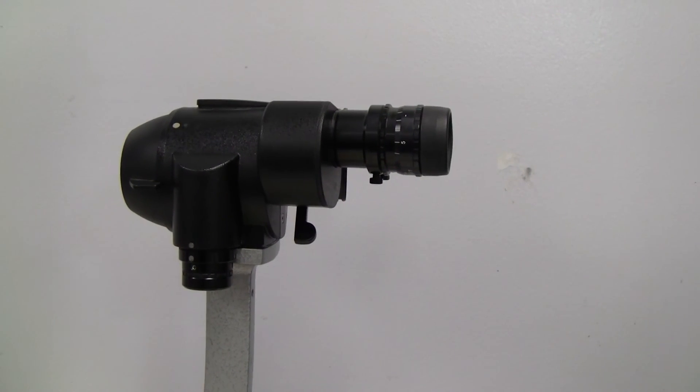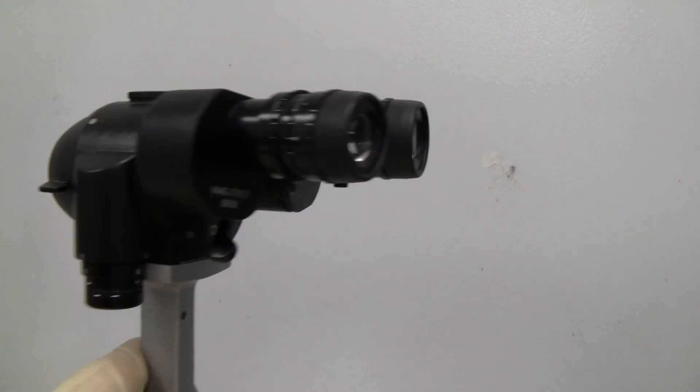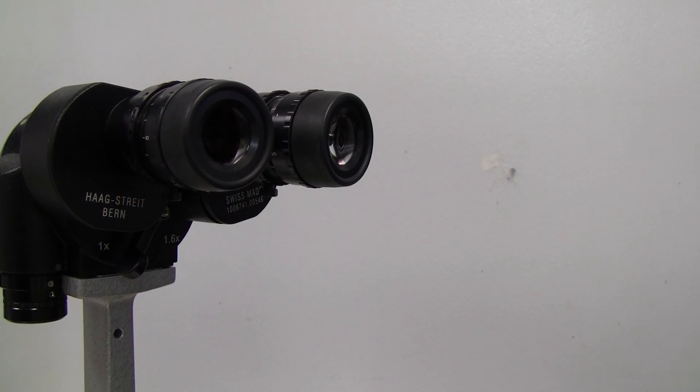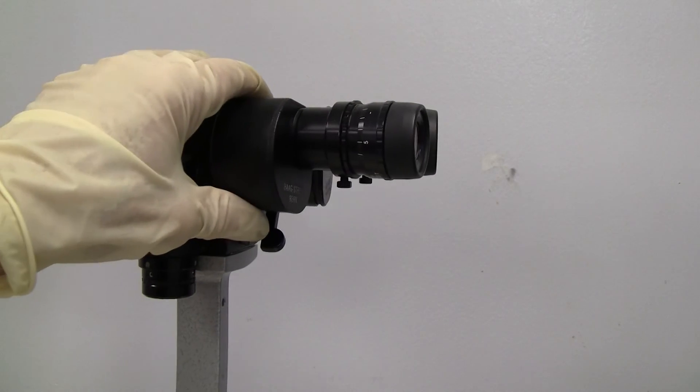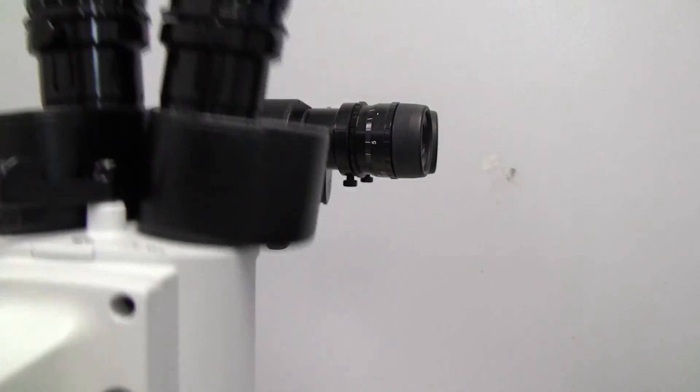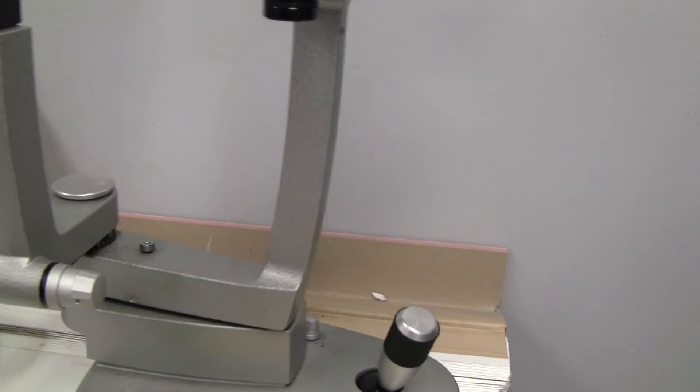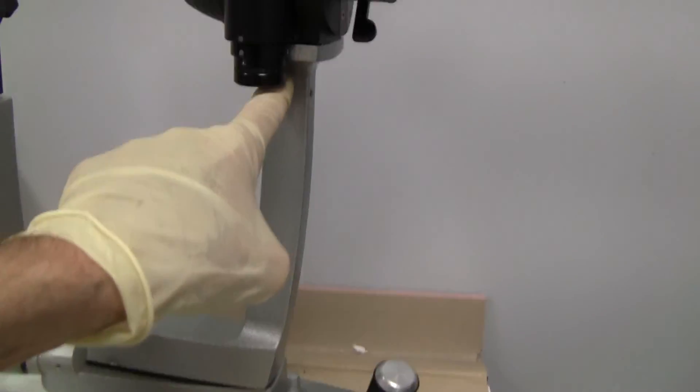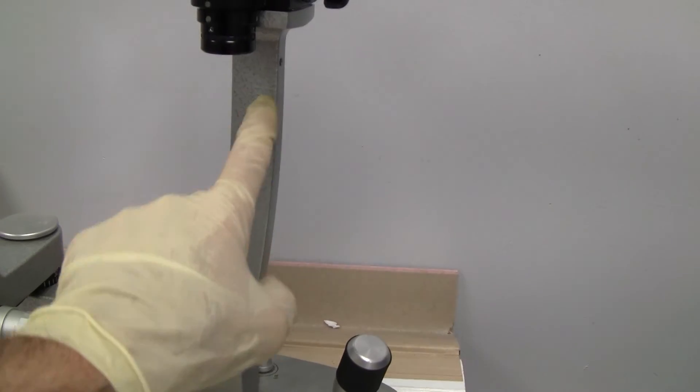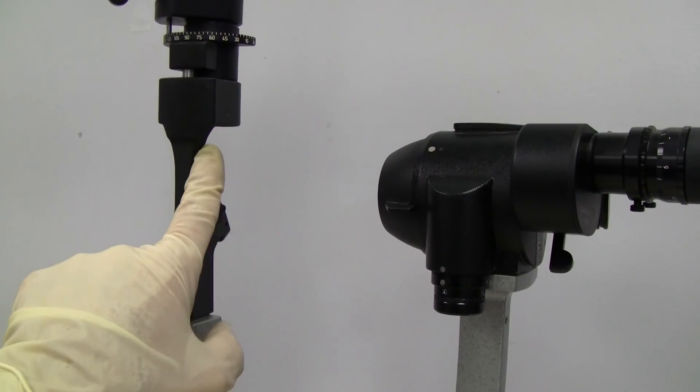Now on the head, Haag-Streit says that you cannot adjust the head if it's out of alignment. And you have to send it in. This is the bottom. And when you send it in, you'd send it in with the whole arm, the whole arm attached to the head. That's the only thing you'd have to send in. You wouldn't have to send in the illumination tower.